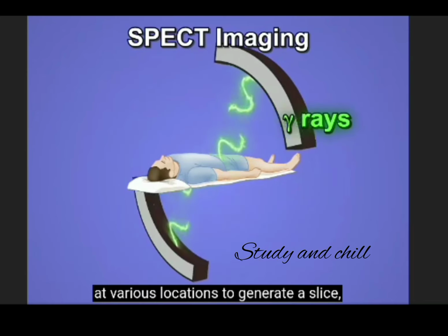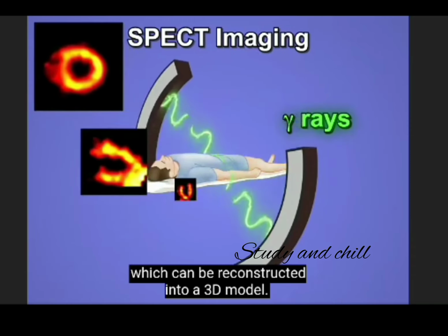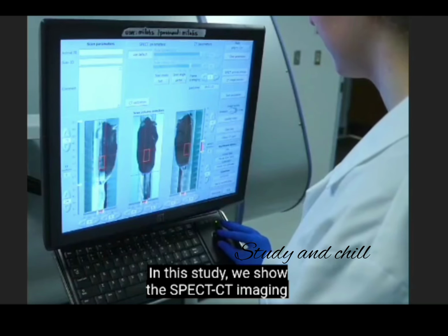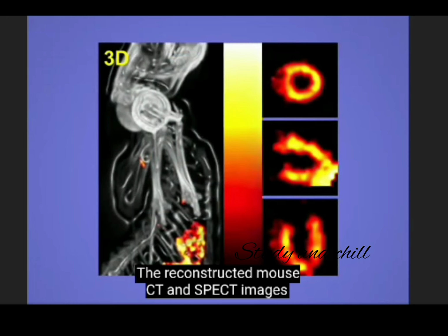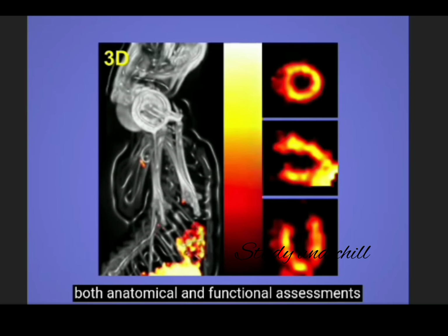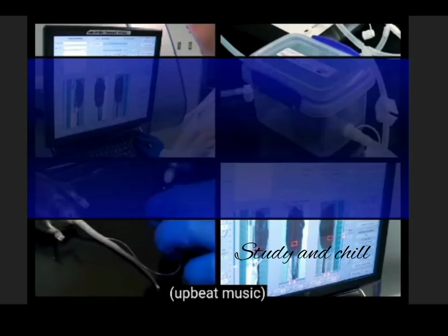In this study, we show the SPECT CT imaging of a mouse. The reconstructed mouse CT and SPECT images are overlaid to create an image that displays both anatomical and functional assessments, as shown by the colored SPECT trace and the grayscale CT scan. Now that we have reviewed the basic principles of SPECT CT imaging, let us now look at the protocol.